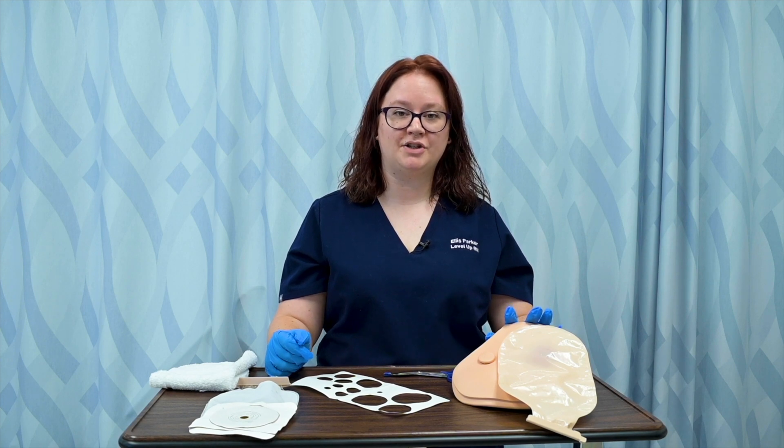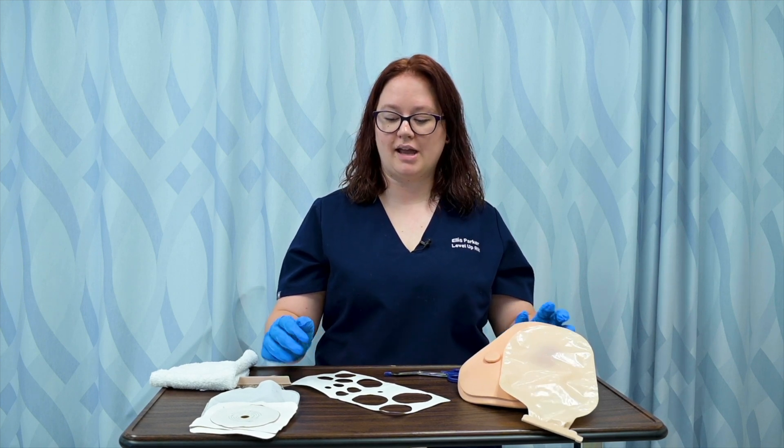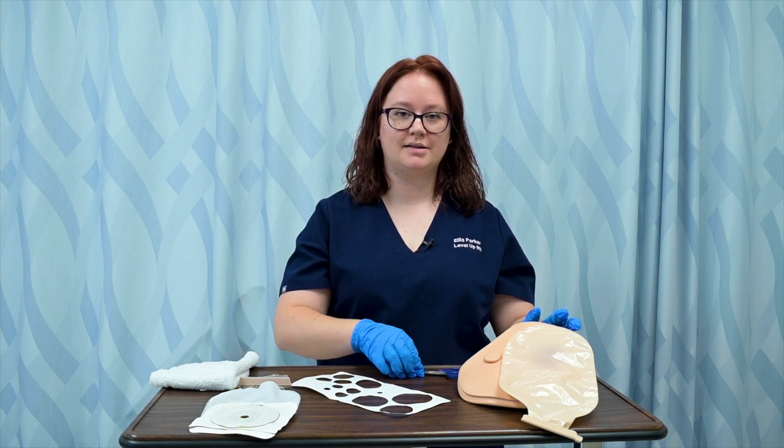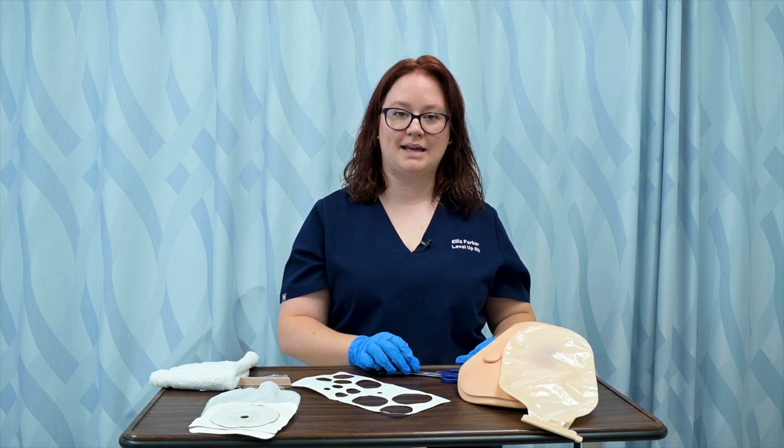In preparation for changing my patient's ostomy bag, I've gone ahead and gotten a new ostomy set, a washcloth, a measuring guide, some scissors, a marker, and some skin prep.